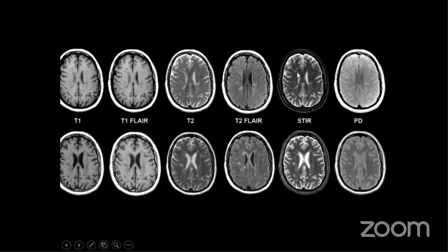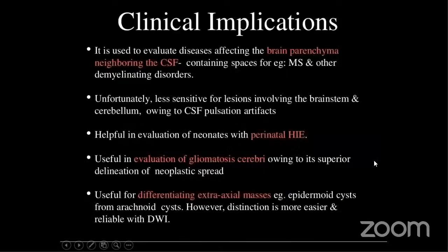T1 FLAIR we do not use routinely. What we use routinely is T2 FLAIR. Okay. Clinical implications. It is used to evaluate... I'm going to go a little faster. I think my time is almost up.